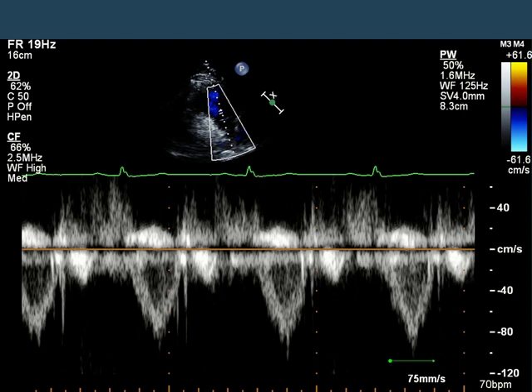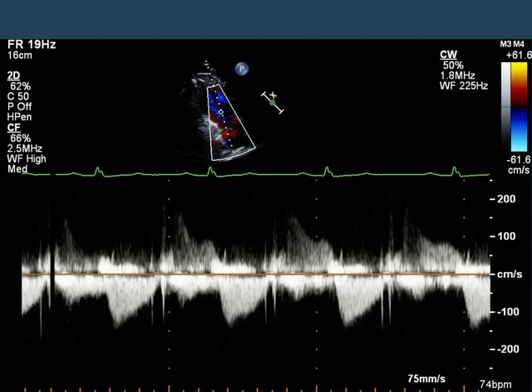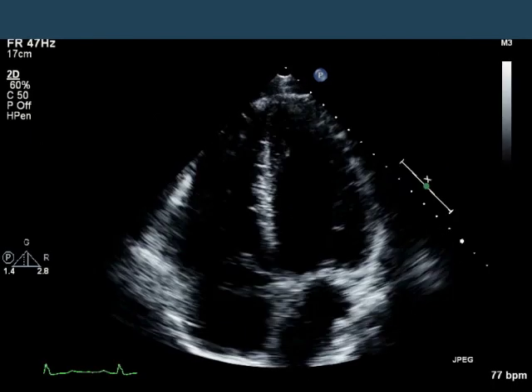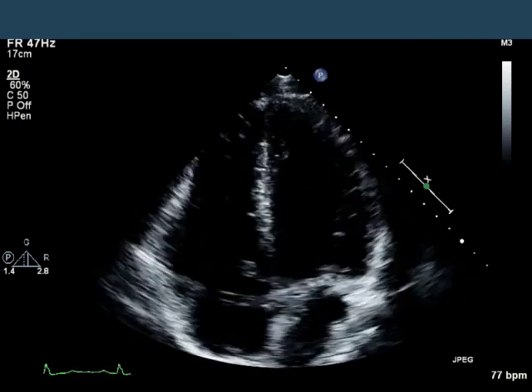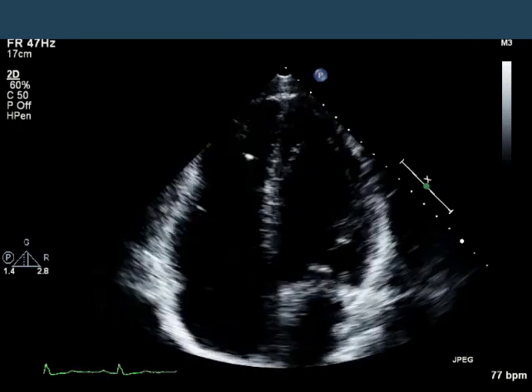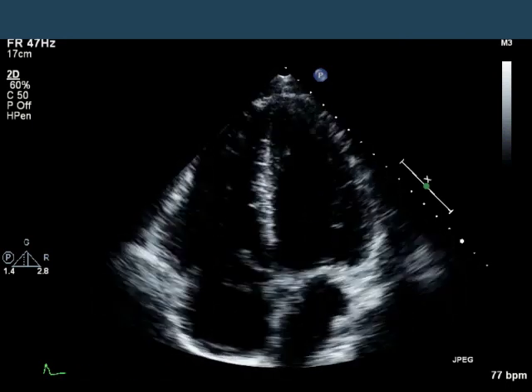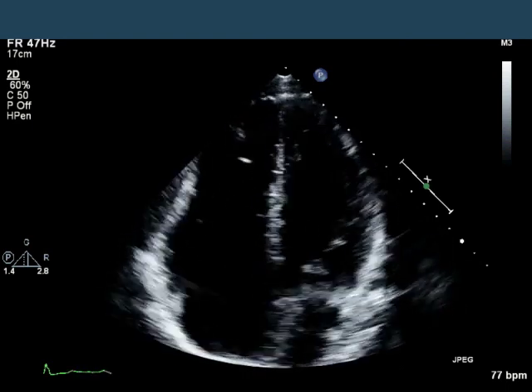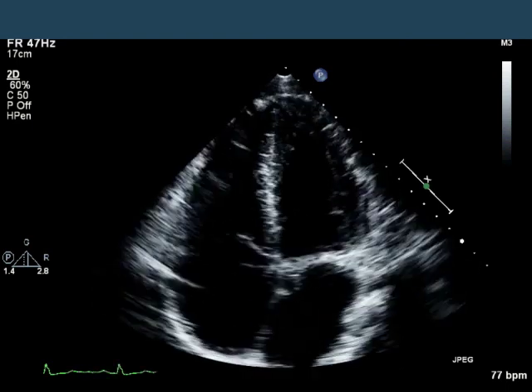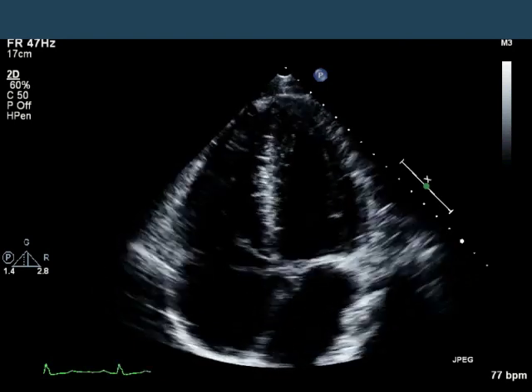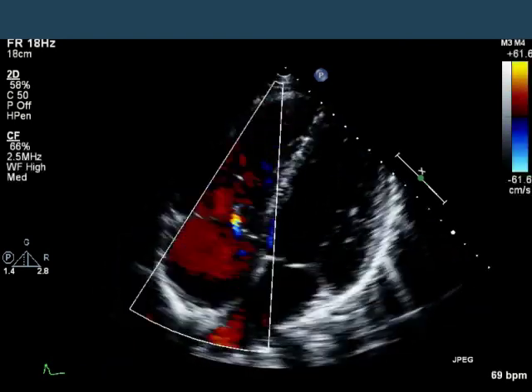The flow through the RV looks good. In the next slide, you can see trivial pulmonic regurgitation, and from these two slides you could pretty much infer there is no pulmonary hypertension present. We now go to the apical four-chamber view. The right side of the heart looks enlarged, but the RV function grossly looks normal. The atrial sizes look normal. The mitral valve looks normal. The only remarkable thing here is the size of the right ventricle.